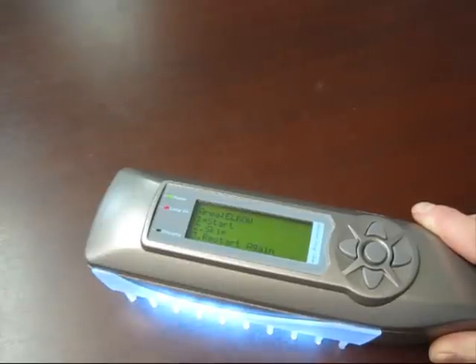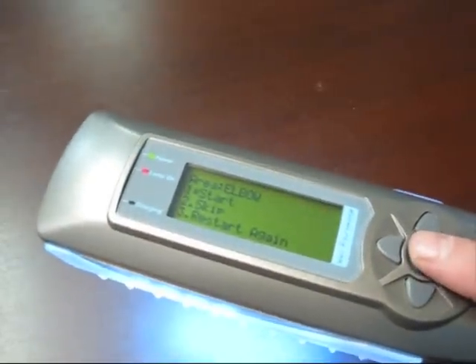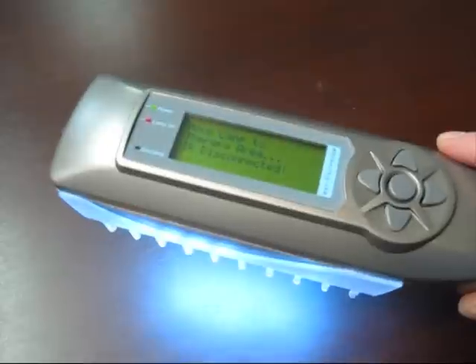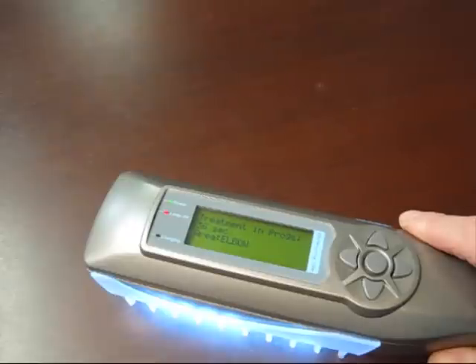Okay, now it's telling us to move to the elbow. We can either start that treatment, skip the treatment, or restart the previous treatment. If we start this next treatment for the second treatment area, being an elbow, just hit enter. Now it's telling me to move the lamp to my elbow, or the next treatment area. Once it's against that treatment area, it'll then start the countdown for my elbow, being 30 seconds, or 35 seconds.